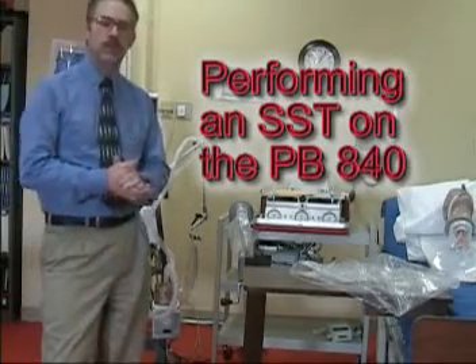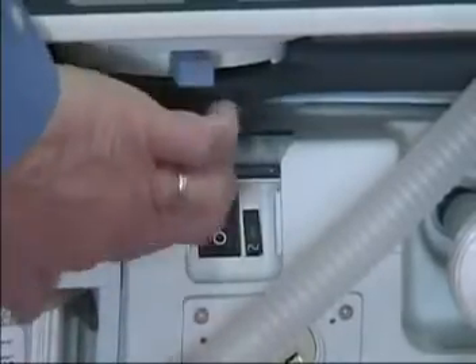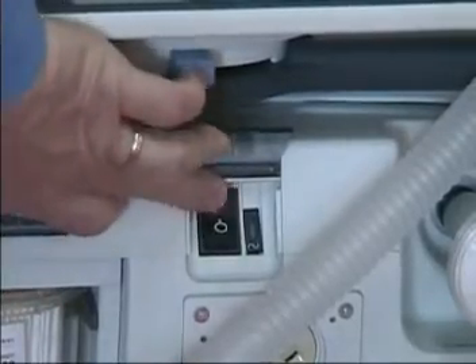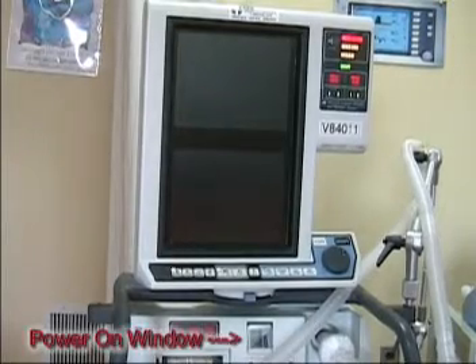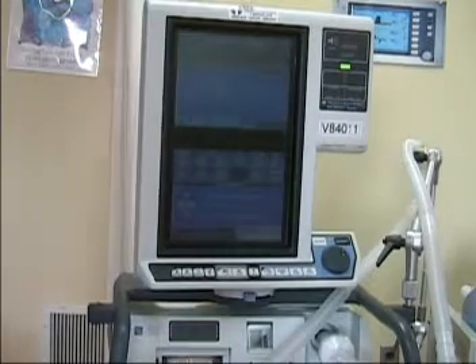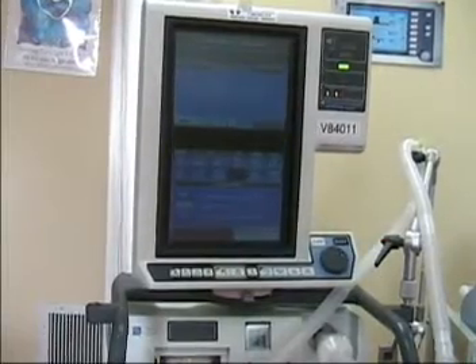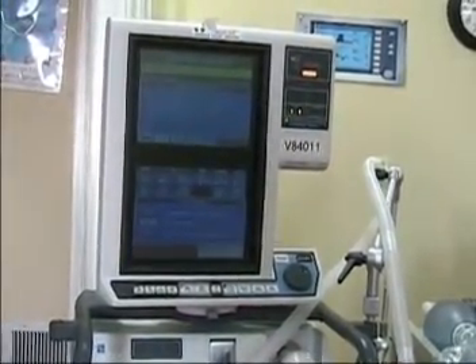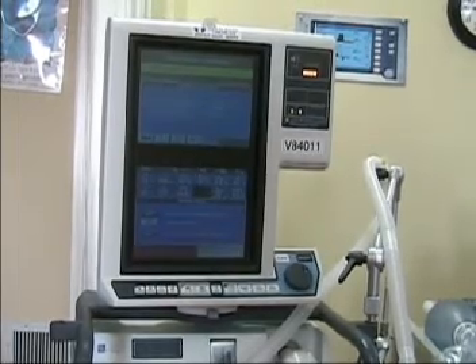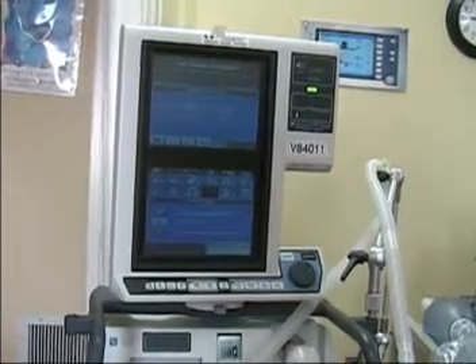The next part will be to do a self-test on the ventilator. Turn on by lifting up this window and pressing the power on. When you press the power on, the machine will go through an automatic test of the system, and it will come to this opening screen.